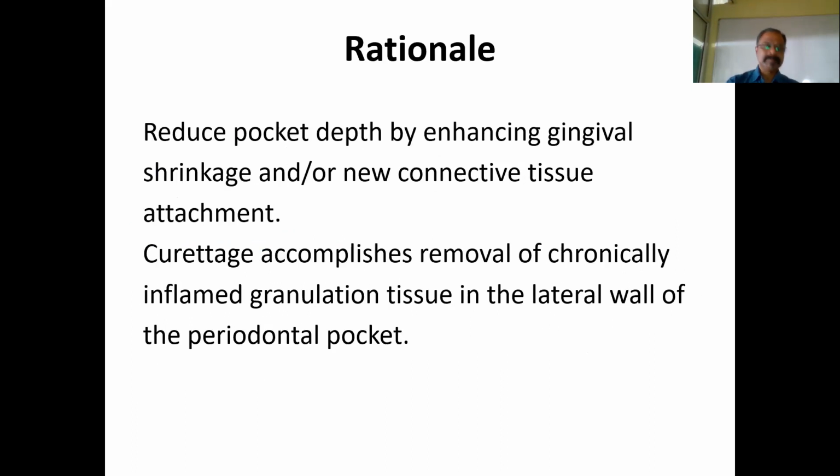So what is the rationale behind this gingival curettage procedure? This is a pretty old treatment aspect, and the rationale is that after you do your supra and subgingival scaling and root planing, you carry out this curettage procedure. What it does basically is it reduces the pocket depth in two ways.